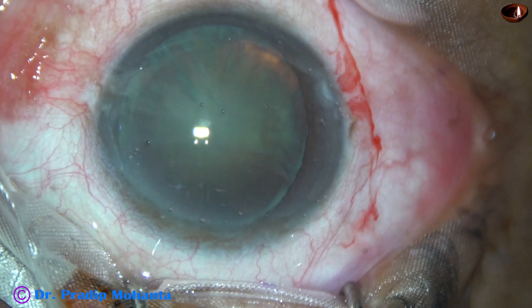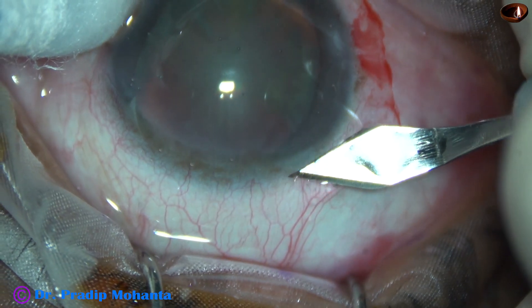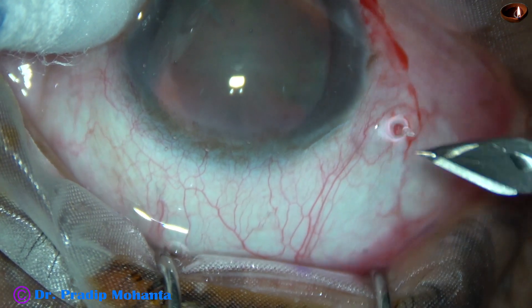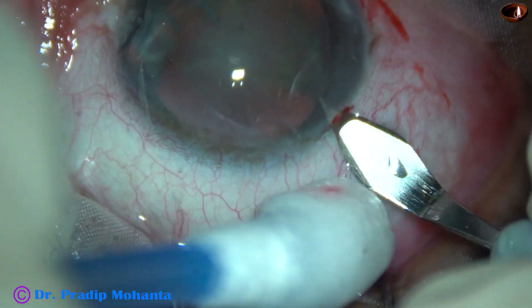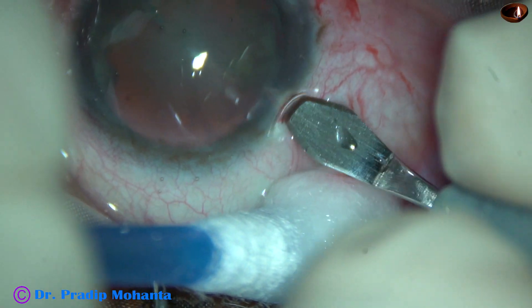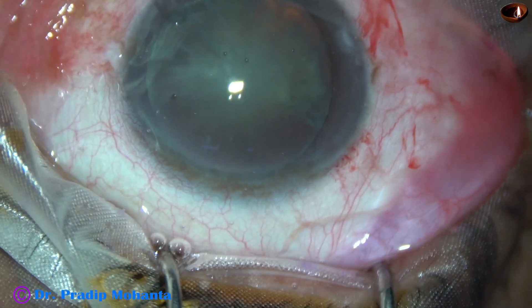And now make the main incision. First, incise the conjunctiva just behind the limbus, and through this incision go forward for some distance, and then go into the anterior chamber.